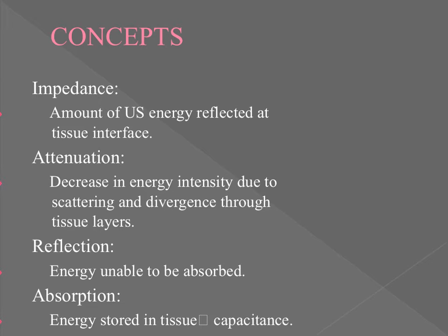Okay. This other concept of reflection, if we were to define reflection, this occurs when a wave can't pass through to the next density layer. So in other words, we have our ultrasound wave traveling to another tissue layer, and before it can even get absorbed by that tissue layer, it gets reflected back towards the top. What am I saying to you guys? If an ultrasonic wave can't pass to the next density, it has to go somewhere.